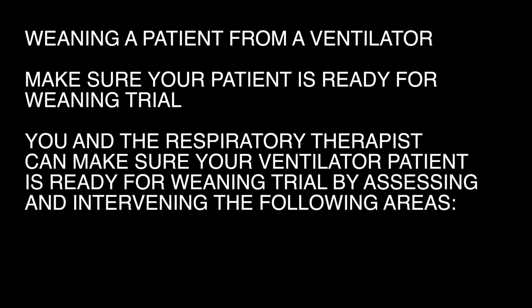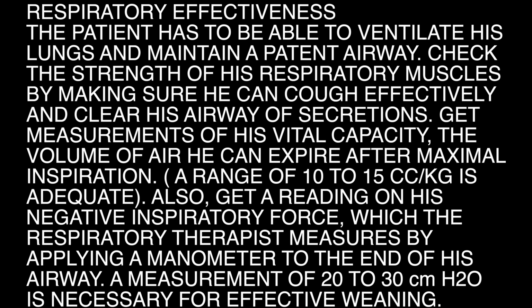Weaning a patient from a ventilator. Make sure your patient is ready for a weaning trial. You and the respiratory therapist can make sure your ventilator patient is ready for a weaning trial by assessing and intervening in the following areas. Respiratory effectiveness. The patient has to be able to ventilate his lungs and maintain a patent airway.